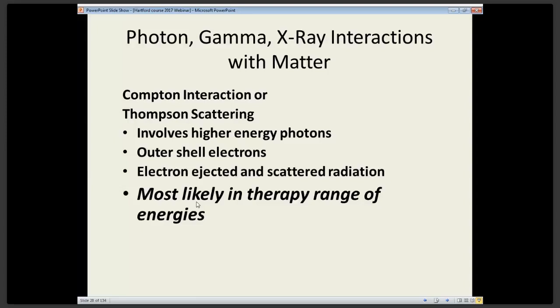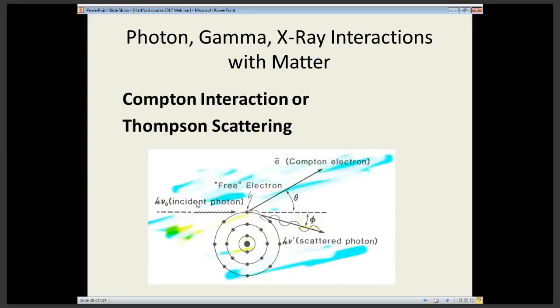But what is causing most of the secondary radiation in the room is not scatter from the patient, because scatter is in the same direction as the incident x-ray. It's leakage from the target assembly of the head of the machine. The head of the machine is covered with lead internally. If you take the fiberglass off, you'll see a lot of lead. There's only so much lead they can put in there without making the machine too heavy that it loses isocenter. So there's a trade-off. There's an FDA standard on how much leakage can be present, but the culprit in the room design is not scatter from the patient, but leakage from the head of the machine.